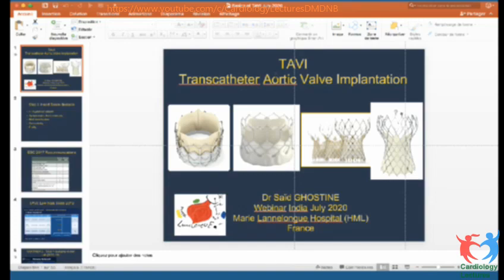I had this once. I said pacing on, so she did the rapid pacing, and then I told my colleague stop, and she stopped the rapid pacing. In our experience, the nurse will stop the rapid pacing when we say pacing off. Pacing on, pacing off. So if another nurse is beginning her experience in the TAVI program and stops the pacing before the deployment, the valve will embolize.